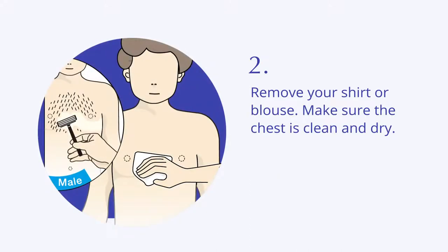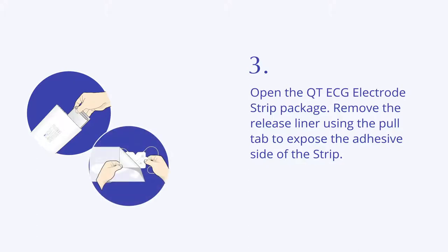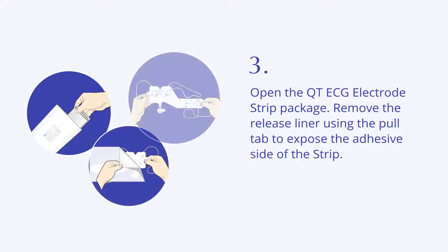Remove your shirt or blouse. Make sure the chest is clean and dry. Open the QT ECG electrode strip package and remove the release liner using the pull tab to expose the adhesive side of the strip.